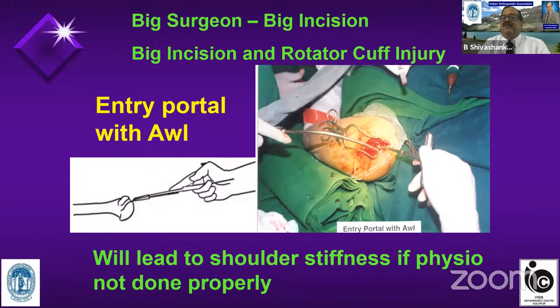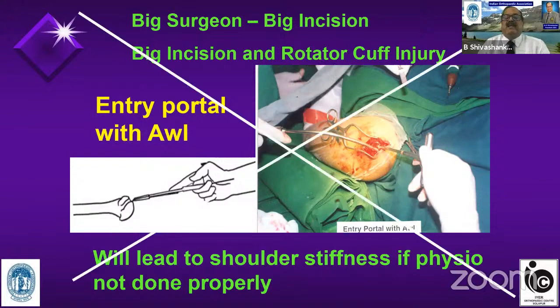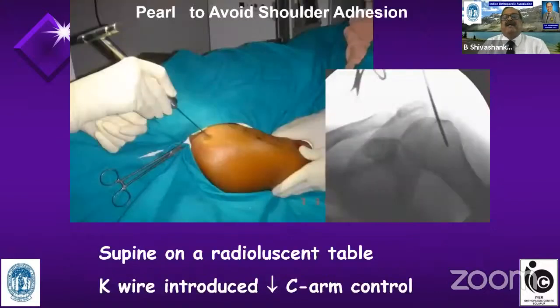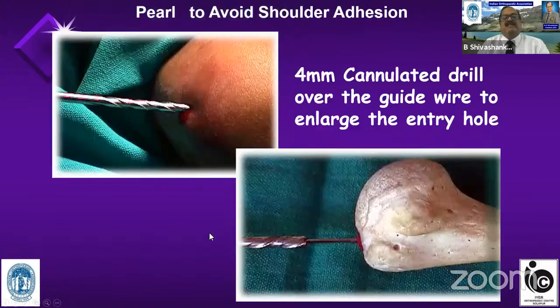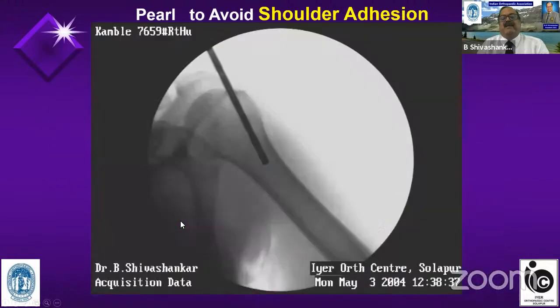They take a lot of time to heal. Always better to go for a keyhole surgery. It's a big no-no for opening up the shoulder. As I said earlier, I pass a guide pin first. Once the guide pin is properly positioned, I take a small incision. Over the guide pin, I drill with a 4 millimeter cannulated reamer.